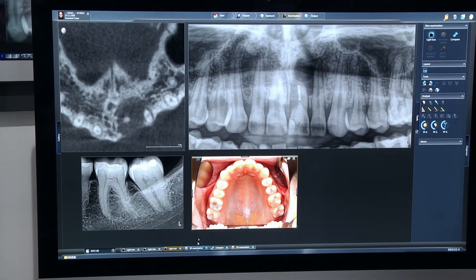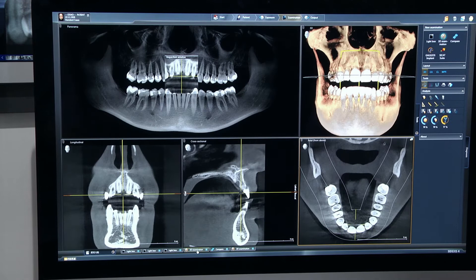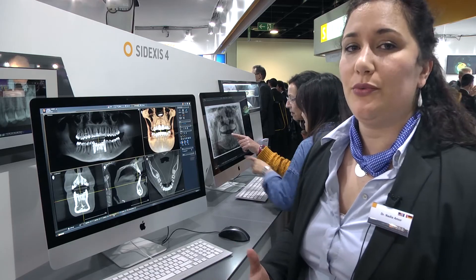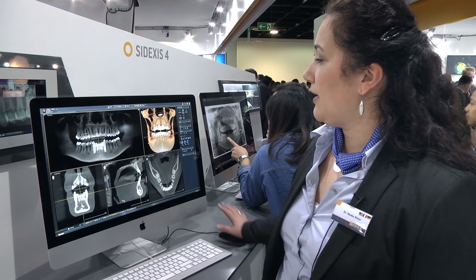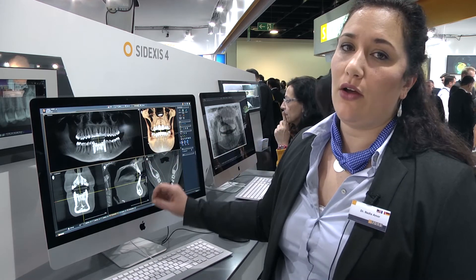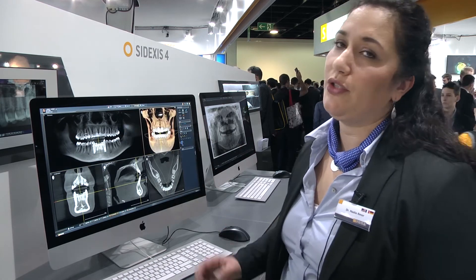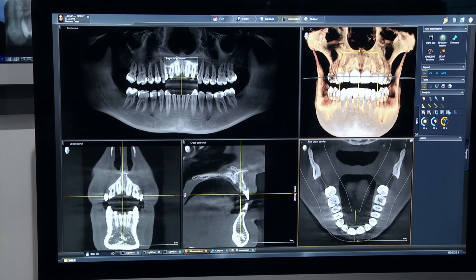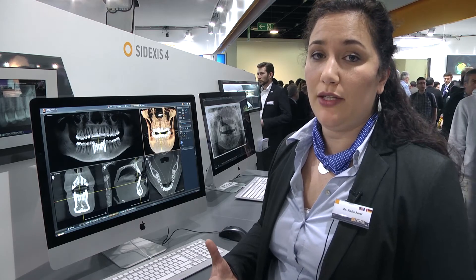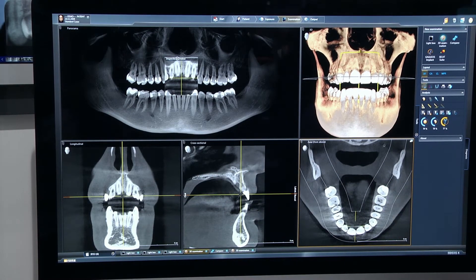There is also a dedicated workspace to do your 3D analysis in more detail. If you just acquired a 3D scan and would really like to scroll through and find all the findings that might be in there, you can check that screen. On that screen you can focus on that one 3D image. You see the 3D render up top — that's very nice for a first overview and patient communication. Then on the upper left you see the calculated panoramic image, and on the bottom you see the actual cross-sectional and longitudinal slices.